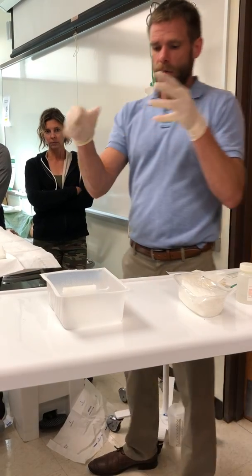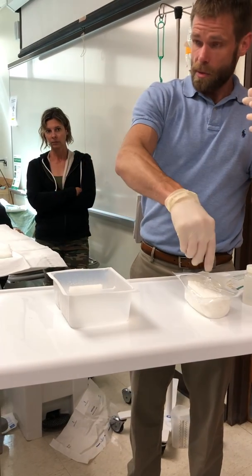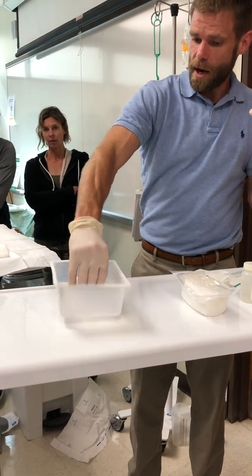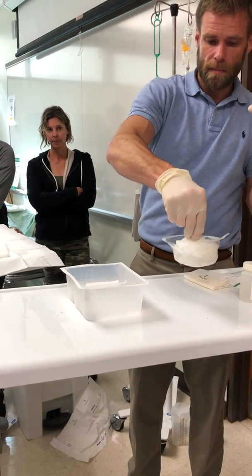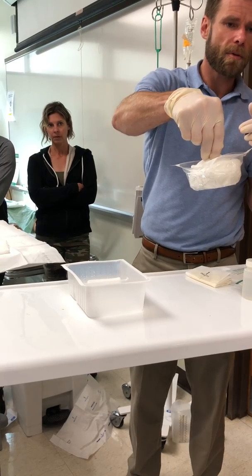Okay, so now we're ready to pack it. This one's easier, so I'm going to do this one, because I can get my hand in here. It's easy to wring out. This one is a little bit more difficult. Can you grab the bottom of that for me?